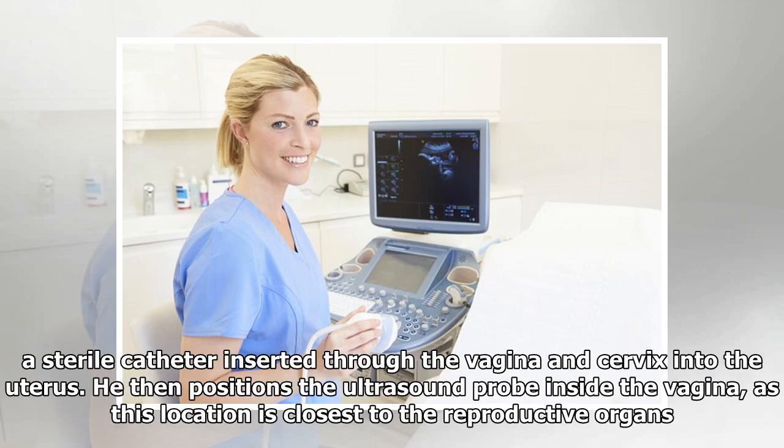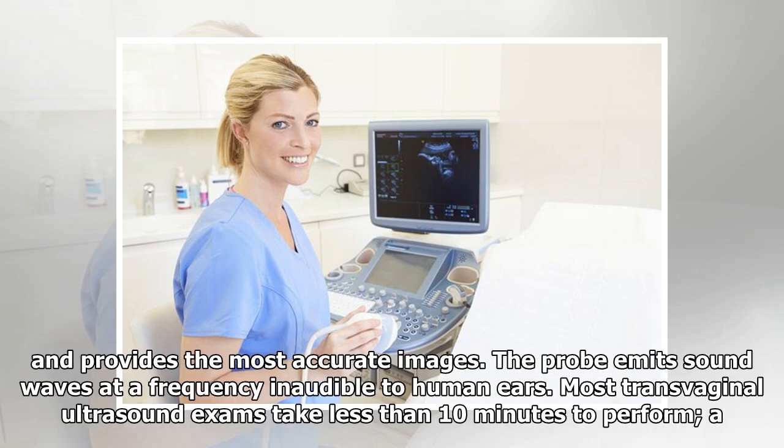To do a saline infusion sonogram, your medical provider first fills the uterus with sterile fluid through a sterile catheter inserted through the vagina and cervix into the uterus. He then positions the ultrasound probe inside the vagina, as this location is closest to the reproductive organs and provides the most accurate images. The probe emits sound waves at a frequency inaudible to human ears.